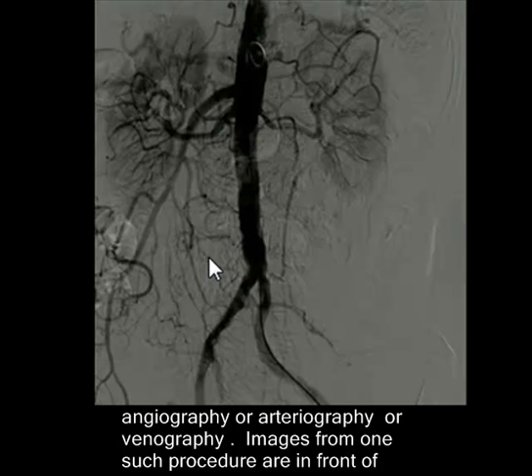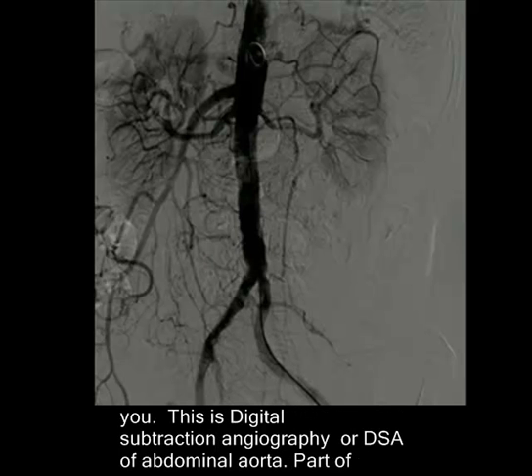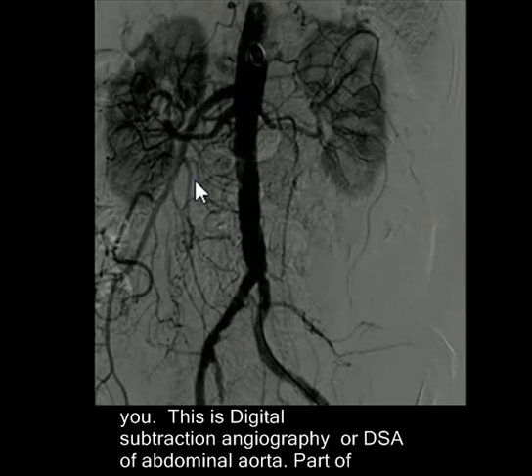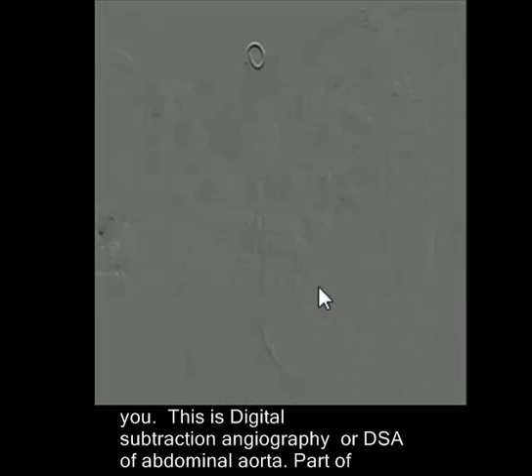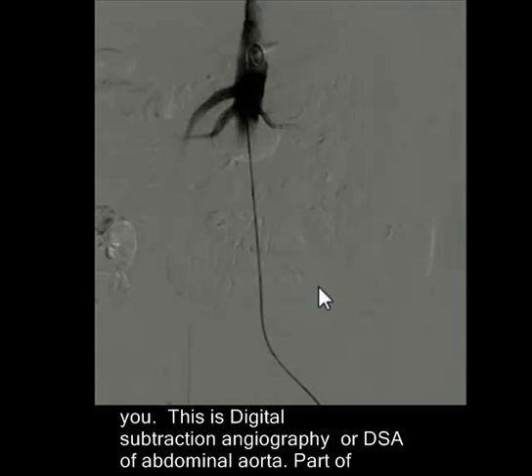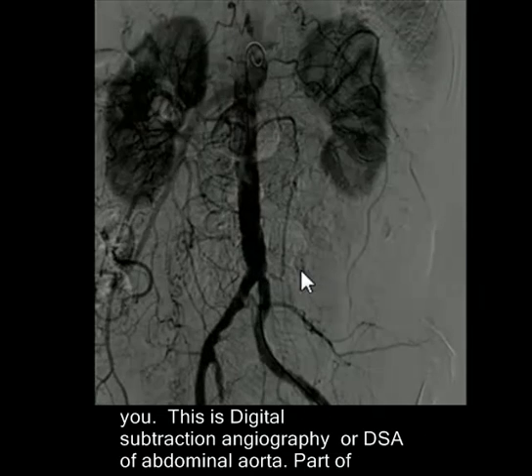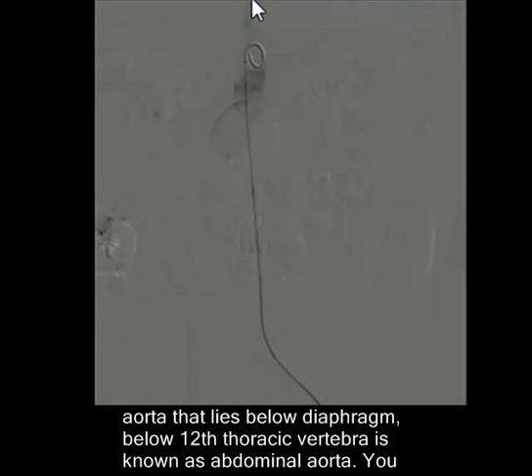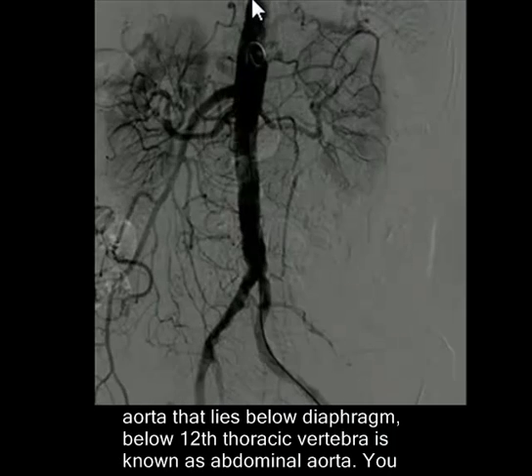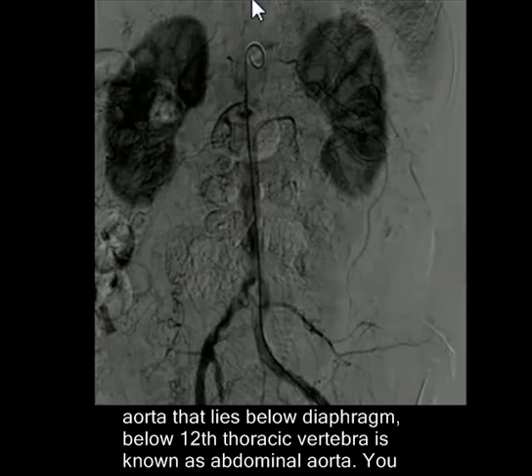Images from one such procedure are in front of you. This is digital subtraction angiography of the abdominal aorta. The part of the aorta that lies below the diaphragm, below the 12th thoracic vertebra, is known as the abdominal aorta.